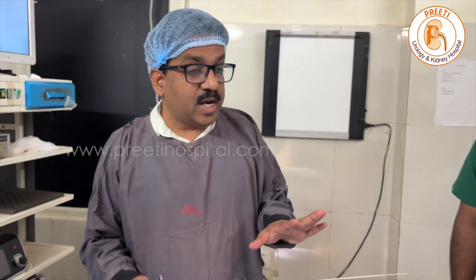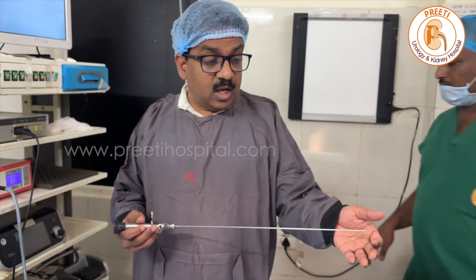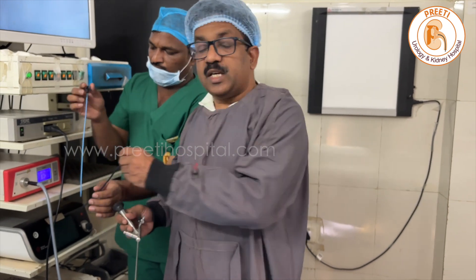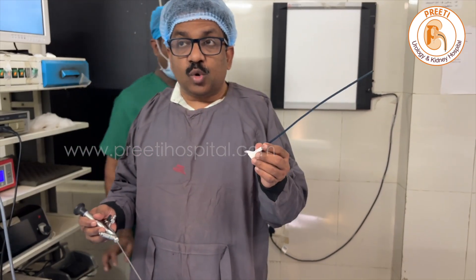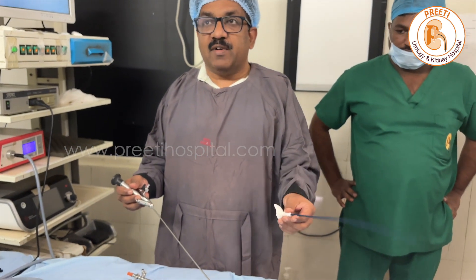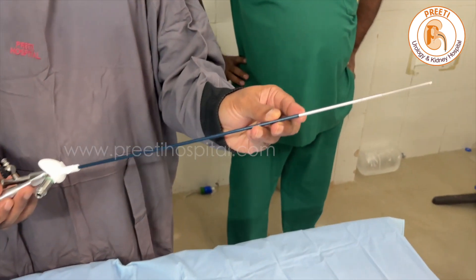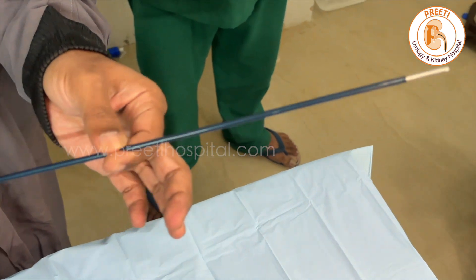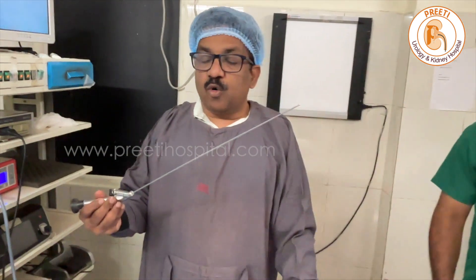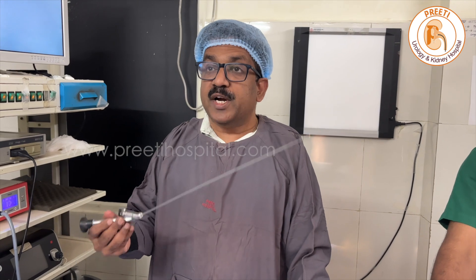Another use I am applying is with an access sheath — 25 cm, Cook, 9.5 by 11 — which snugly fits in this, meaning you can pass over this as a visual obturator technique. So these are the uses of the 4 by 6.5 Wolf needle scope.